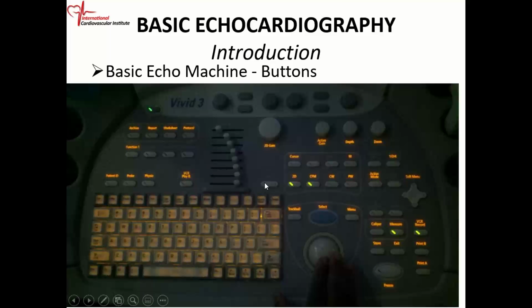So these are some of the buttons that you want to have. This is a trackball. You can move stuff around with the trackball. This is a 2D button. If you want to see your grayscale, and we'll go over that, don't worry, but if you want to see your two-dimensional image, you press that button. If you want to see an M mode echo, you press this button. And then we have Dopplers. You have a pulse wave Doppler button, a PW, a continuous wave Doppler button, and a color flow Doppler button. So you press that button.